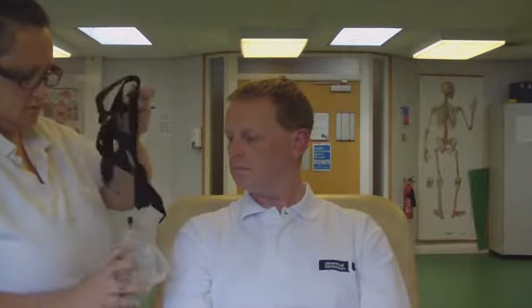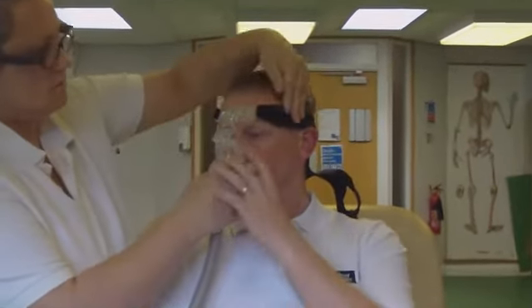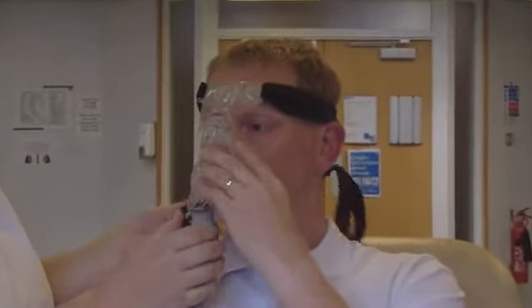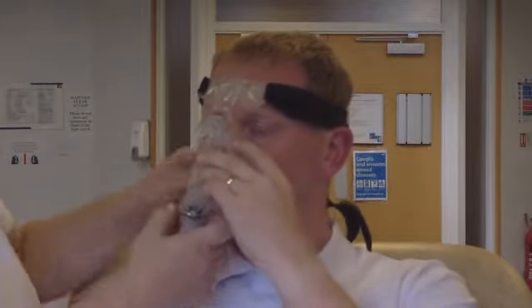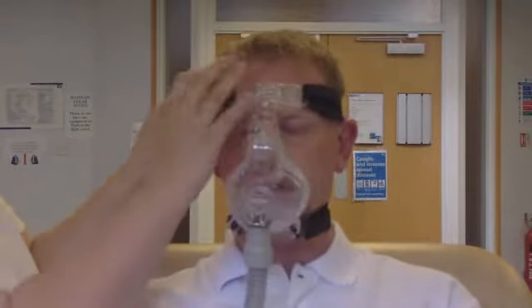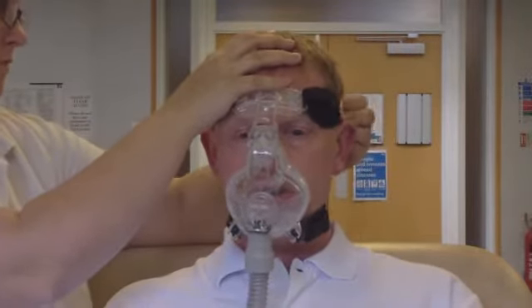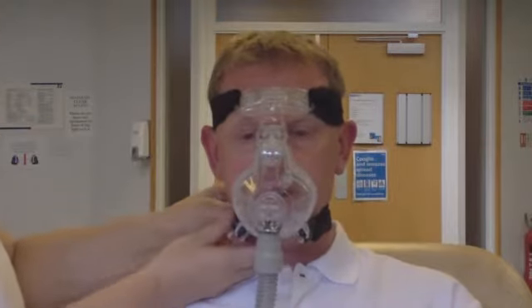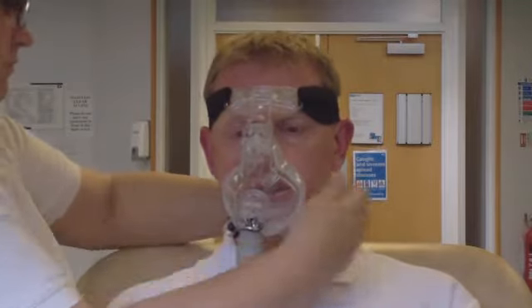Okay. Applying the mask to the patient's face. So this is a full face mask. The most efficient way of putting this on is to place the mask over the patient's nose and mouth, put the top strap around the patient's head to make sure that that's a reasonable fit, and then clip on the two bottom straps. Now this has to be a good tight fit, but not too tight, because you don't want to create pressure sores. So it's a bit of a balancing act of fixing the Velcro straps on the head, making sure that it's comfortable, and that the mask is straight on the patient's face.